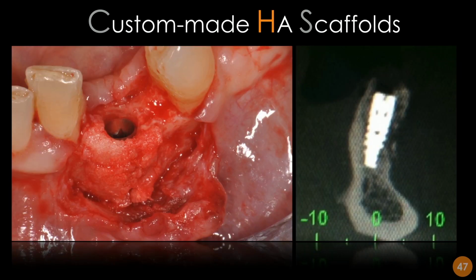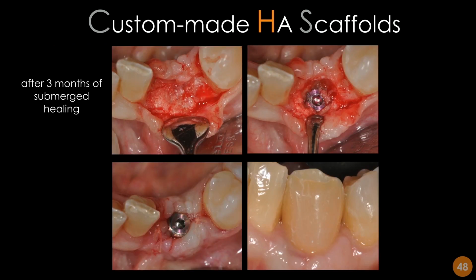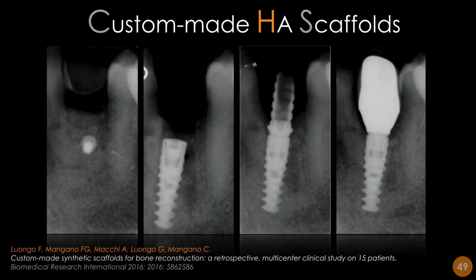In this case the result is very satisfactory, as we can see. And also after a period of undisturbed healing, the implant can be loaded without any problem, and then we can put our crown, and the treatment has been very successful. So it's another option from CBCT. We can use DICOM files to design and fabricate custom-made scaffolds for bone regeneration. And everything works quite well, as we can see radiographically.